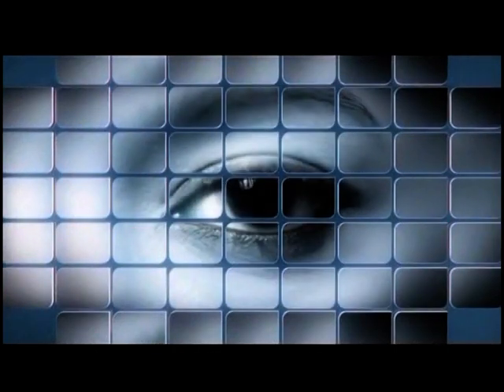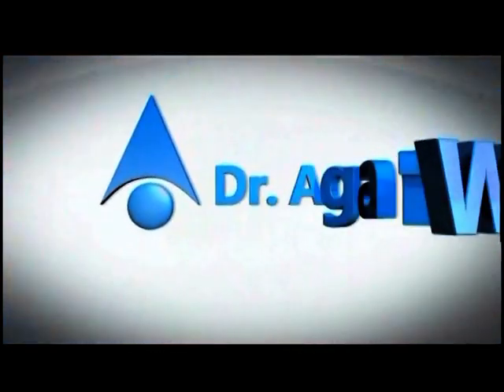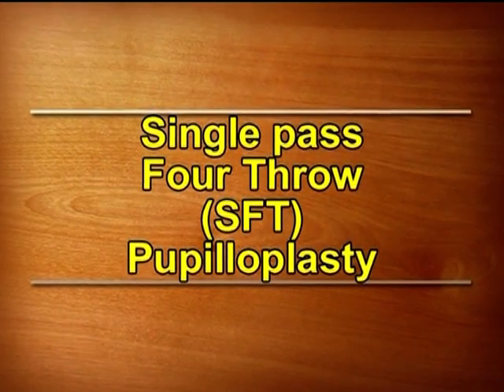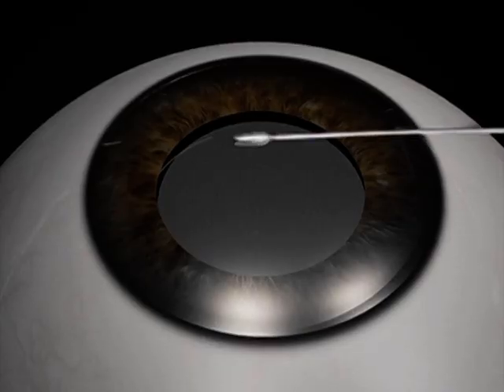None of the producers have any financial interest in the products or procedures shown. Single pass 4-throw pupilloplasty is a new technique for performing pupilloplasty.